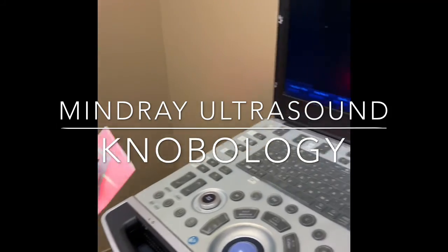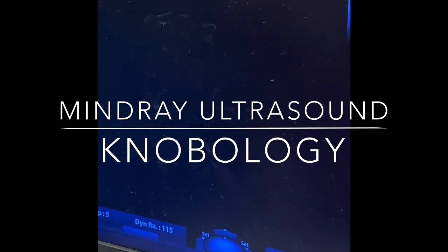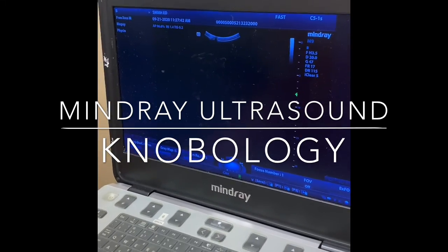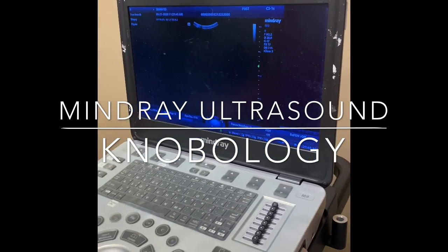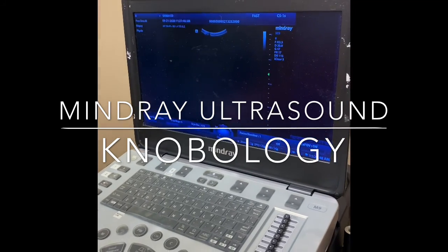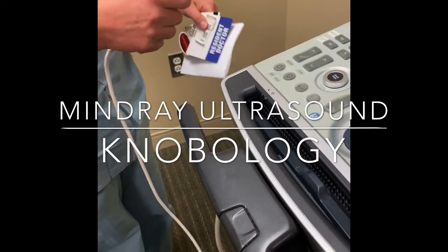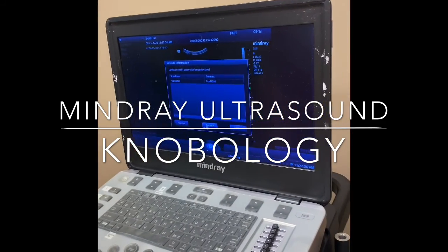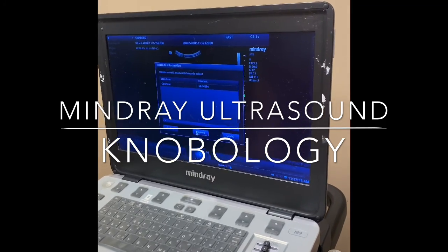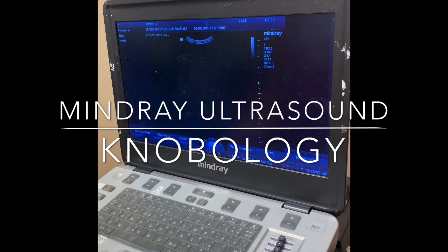It's trying to scan, and it'll generate at the top. You might get a prompt asking whether you want to update the exam with this information. You can then also scan your user ID, and you get a prompt on the screen saying, do you want to append the exam or replace it? I click append. And now the patient information and provider information is labeled.